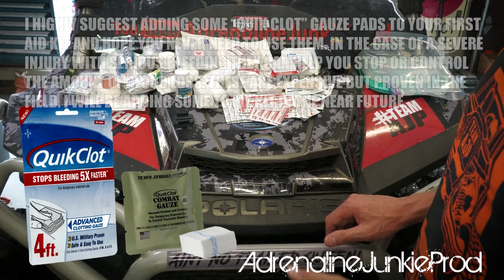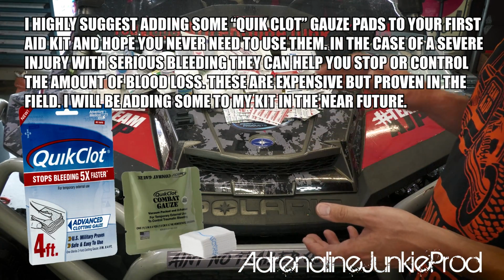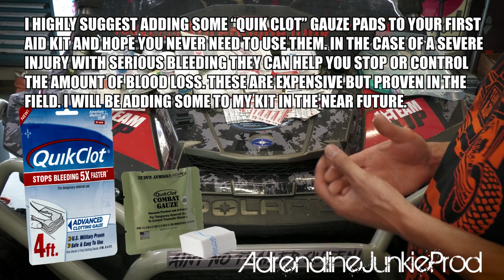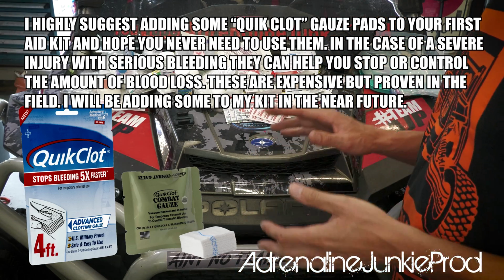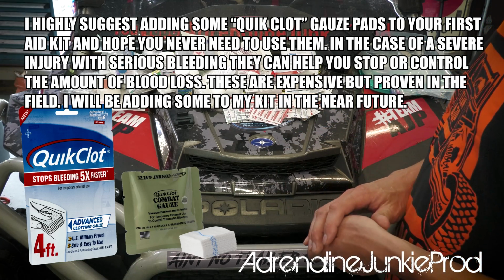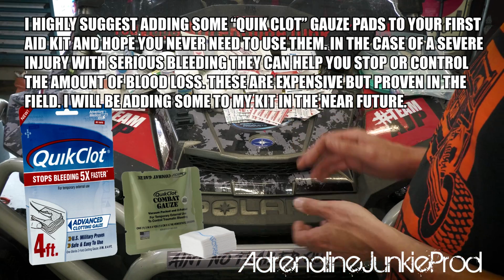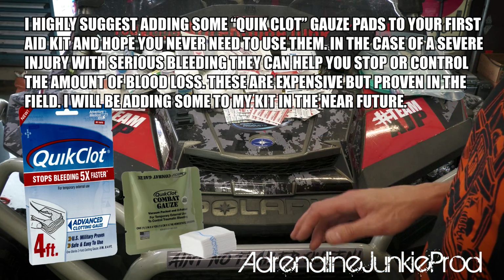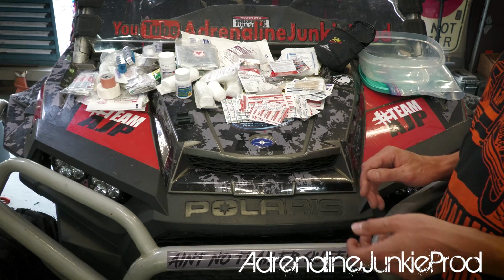If there's serious trauma, then your number one goal is to use these items here to not even so much clean the wound, but to apply pressure to the area and hopefully stop the bleeding as much as you can, and then safely transport the person where they can get more medical assistance or wait for medical assistance to arrive at your location.